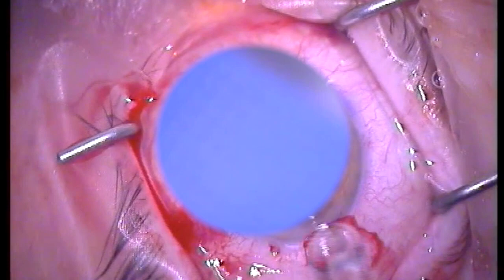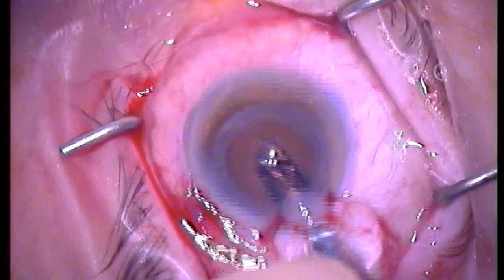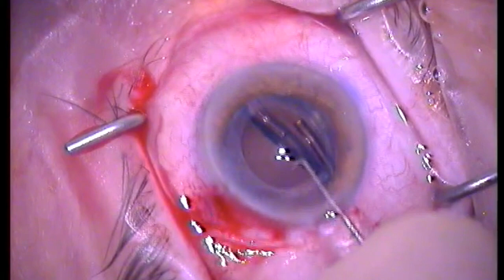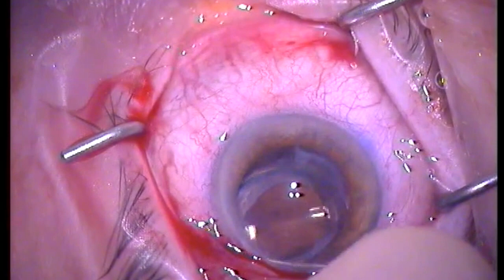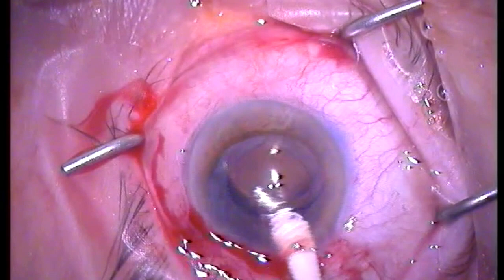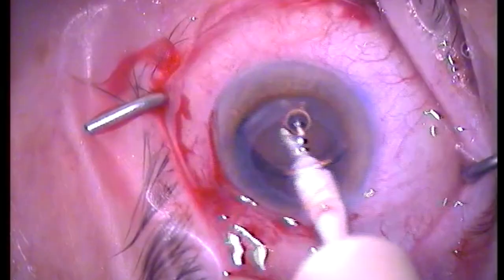I will also use a little click rotation to the right to lock the lens in position so that it doesn't move into the AC as it's unfolding, and here you can see stressing the haptics into the bag. Irrigation and aspiration of the viscoelastic from behind the lens first, and then from the entire chamber over the lens.